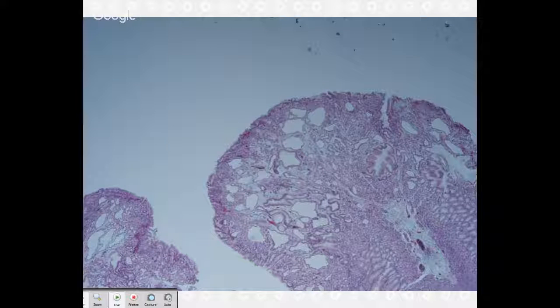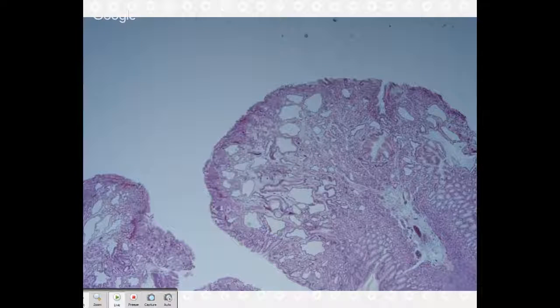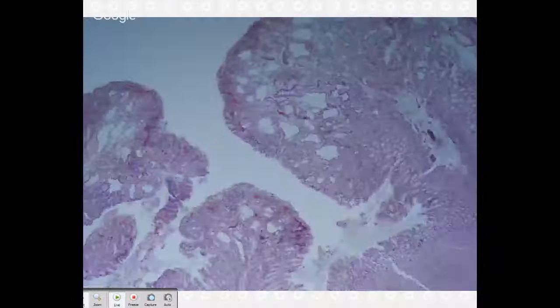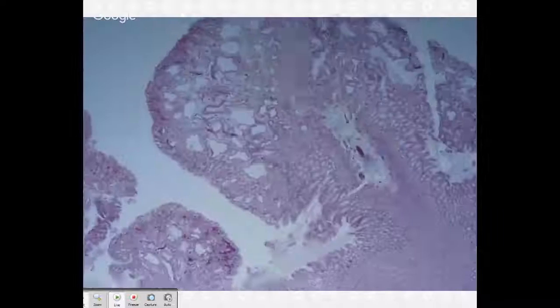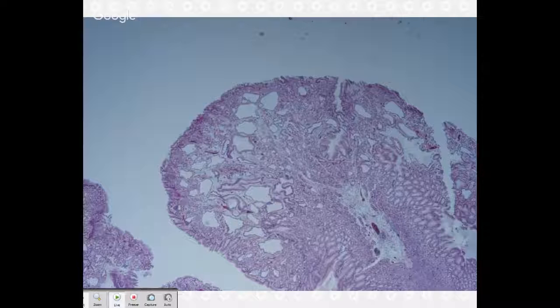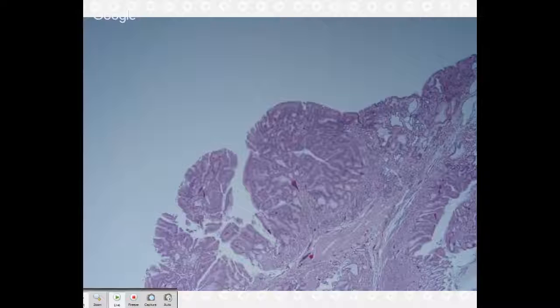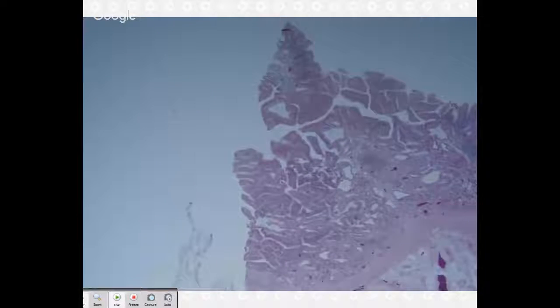Now, in patients who have FAP, their fundic gland polyps actually aren't reactive. They're actually neoplastic. They carry the same APC mutation that defines their disease, and they can become dysplastic. And so anytime a clinician is surveilling one of their FAP patients and they see one of these big fundic gland polyps, if it's a centimeter or larger, they excise it, in part because they can become neoplastic, or dysplastic, I should say, in this population, and can progress to frank carcinoma.